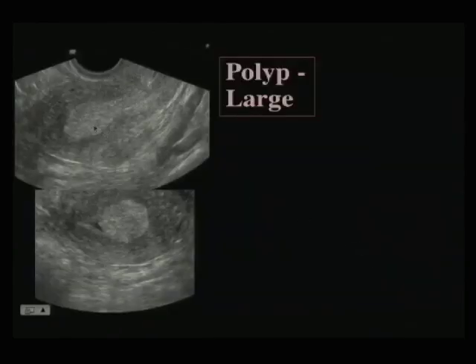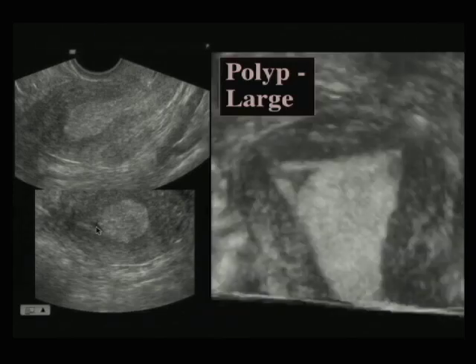Now here is a longitudinal view of the uterus showing a rather thick endometrium right there. That thick endometrium is really ill-defined on this one image. And unless you had other images, you wouldn't know why the endometrium is thick. On the transverse view, you get an inkling that the reason it's thick is because it's a polyp, because there's a little piece of the cavity here that's separate and contains a little bit of fluid. But when you render the coronal view, you can actually identify the polyp within the cavity. It's a big polyp, with a tiny bit of fluid outlining one of the cornu right here.